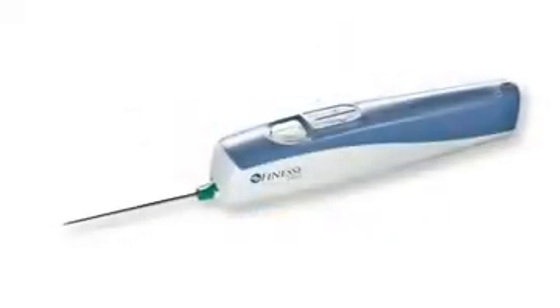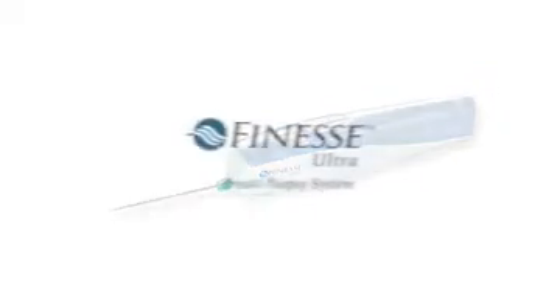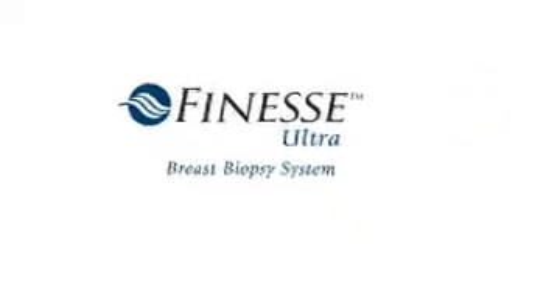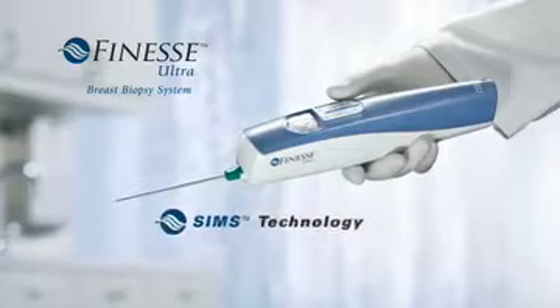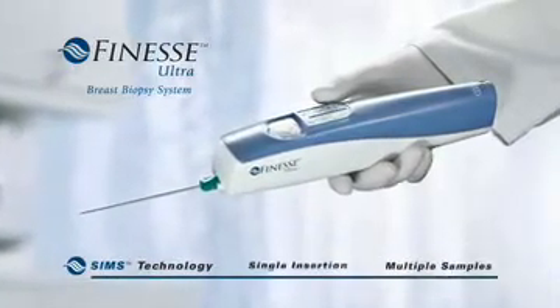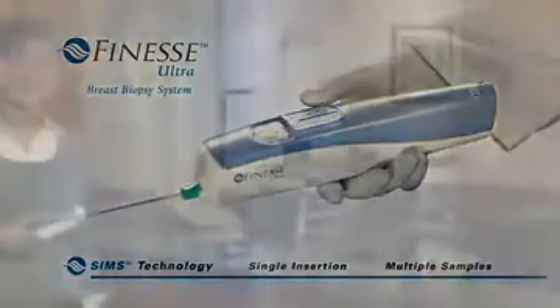We're pleased to introduce the newest innovation in the Bard family of biopsy solutions: the Finesse Ultra breast biopsy system. It's the only handheld vacuum-assisted breast biopsy system with SIMS technology, giving doctors the ability to acquire multiple samples with a single probe insertion. In your hand, it's Finesse.